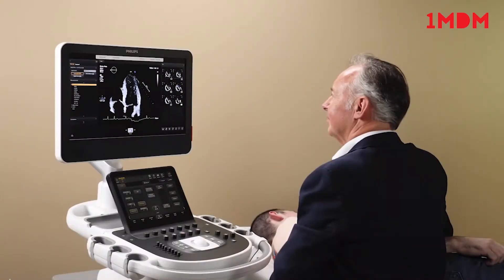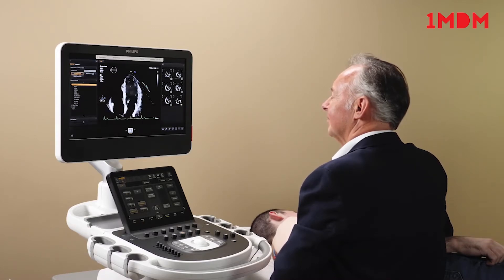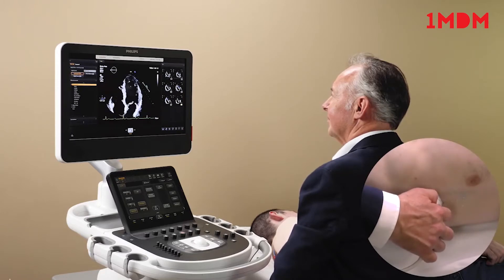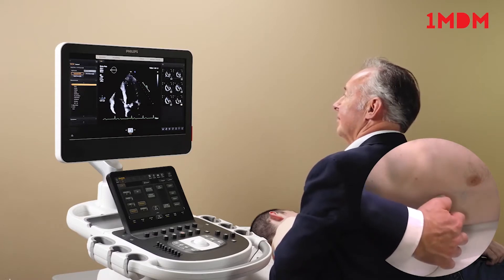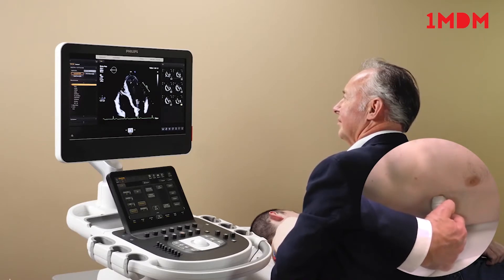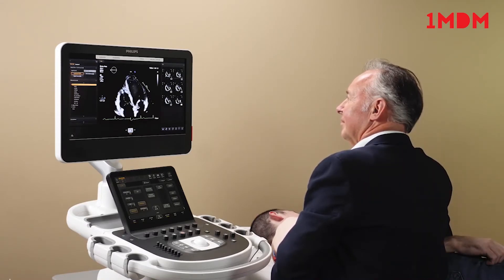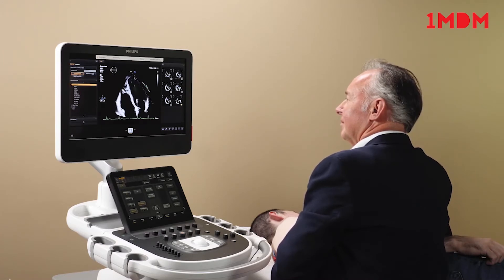To calculate the longitudinal strain of the right ventricle, we need to acquire an RV-focused apical 4 chamber view with a minimum loop length of two beats. Make sure you have a good ECG signal. Start from an apical 4 chamber view and slide the transducer to a more lateral position, keeping the left ventricular apex at the center of the image while displaying the largest basal RV diameter. This is the most reproducible apical view of the right ventricle, allowing assessment of the right ventricle insertion point by avoiding RV foreshortening.